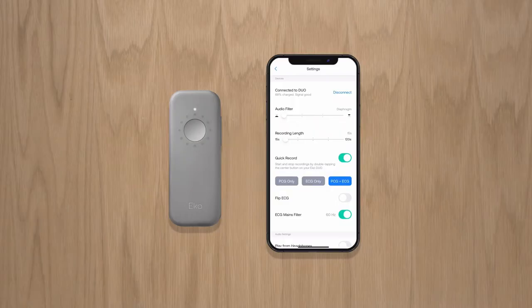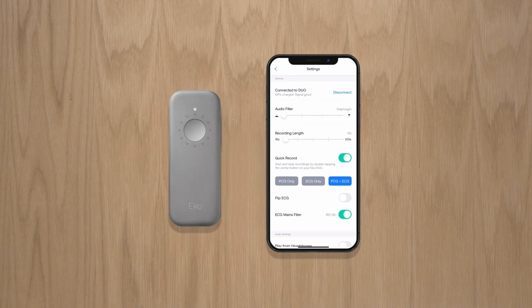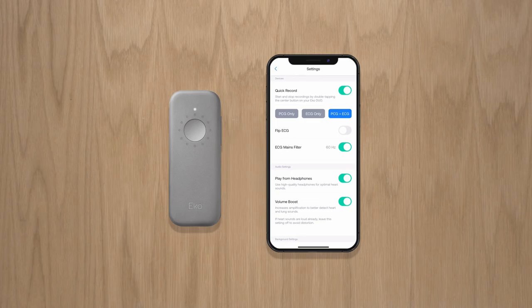To review and adjust your settings, open the menu on the upper left side of the screen. Here you can view the battery percentage for your Duo, change the audio filters, adjust recording length and more.